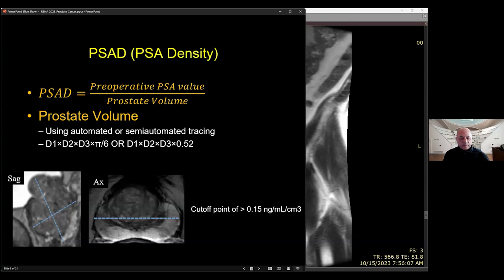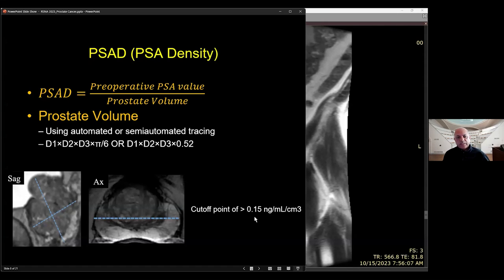Prostatic volume is easily calculated on MRI — either auto-segmented with software or manually by taking the three maximal dimensions (superior-to-inferior, anterior-to-posterior, and transverse) and multiplying by 0.52. If you put the PSA value in the numerator and prostatic volume in the denominator, the cutoff is 0.15. Values above 0.15 suggest that beyond glandular volume, something else may be contributing to PSA, so you should look hard throughout the gland to ensure you're not missing a tumor.